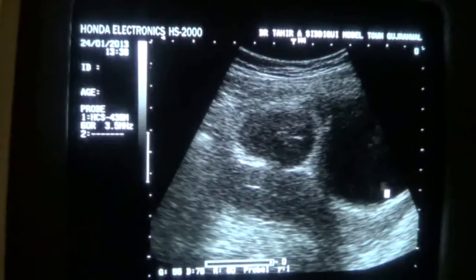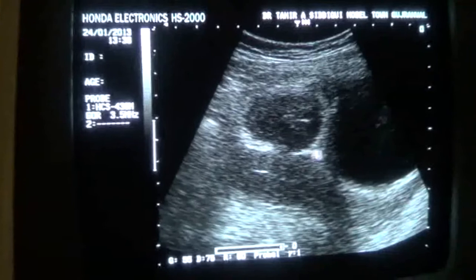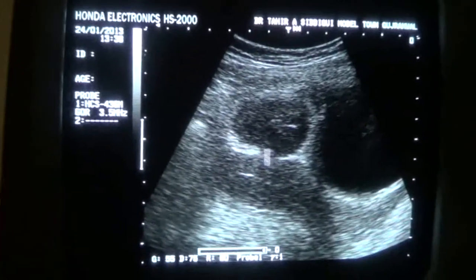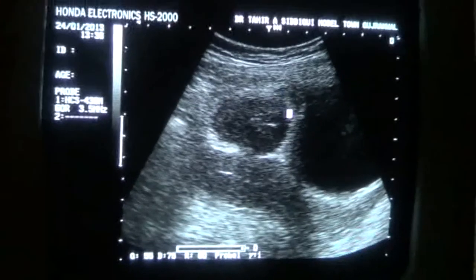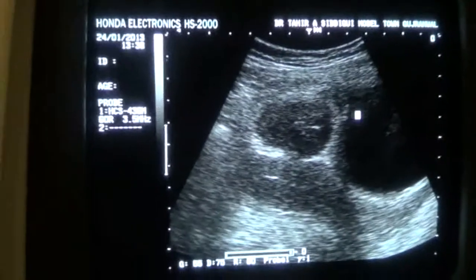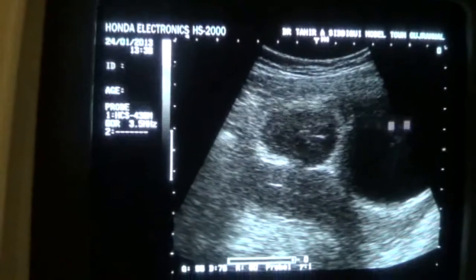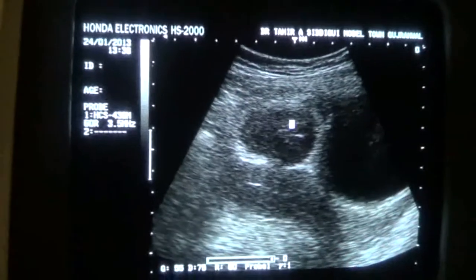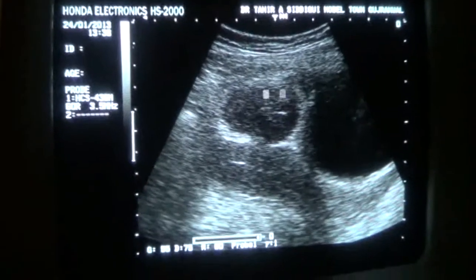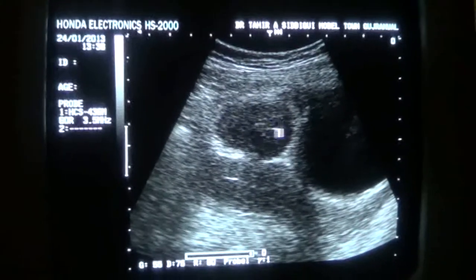This is the urinary bladder, and here you see a breach at the anterior wall of the uterus, and from this breach we see a well demarcated thick wall cystic area protruding anteriorly adjacent to the lateral wall, right lateral wall of the urinary bladder, and there are internal echoes seen, and there are coarse echoes.